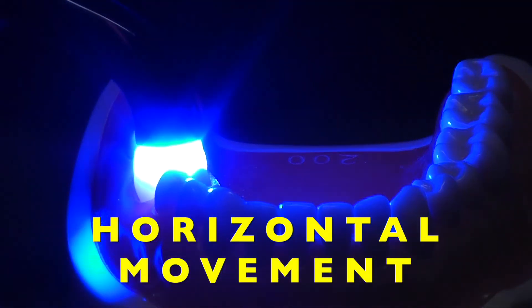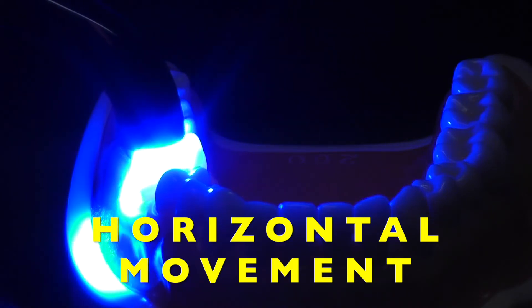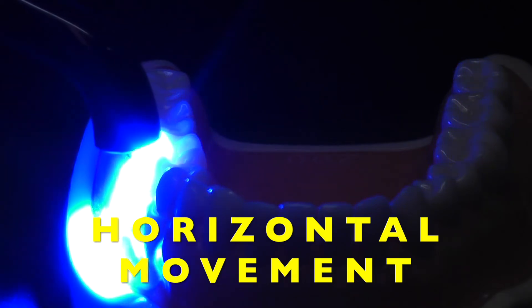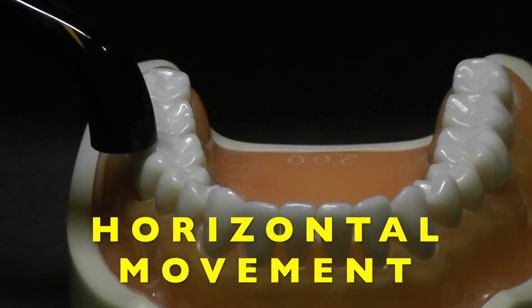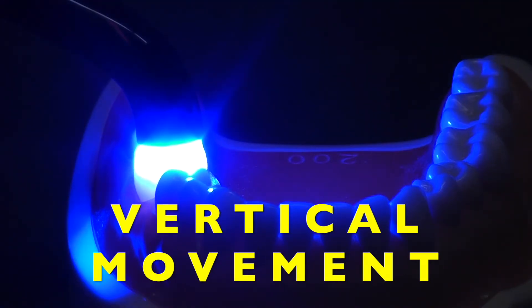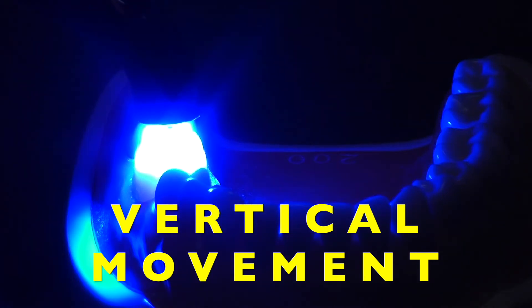Here we can see the light in action. As you move the light horizontally, first there is a slight vibration and then eventually the light turns off. We get the same feedback when we move the light vertically — initially there is a slight vibration and then eventually the light turns off.